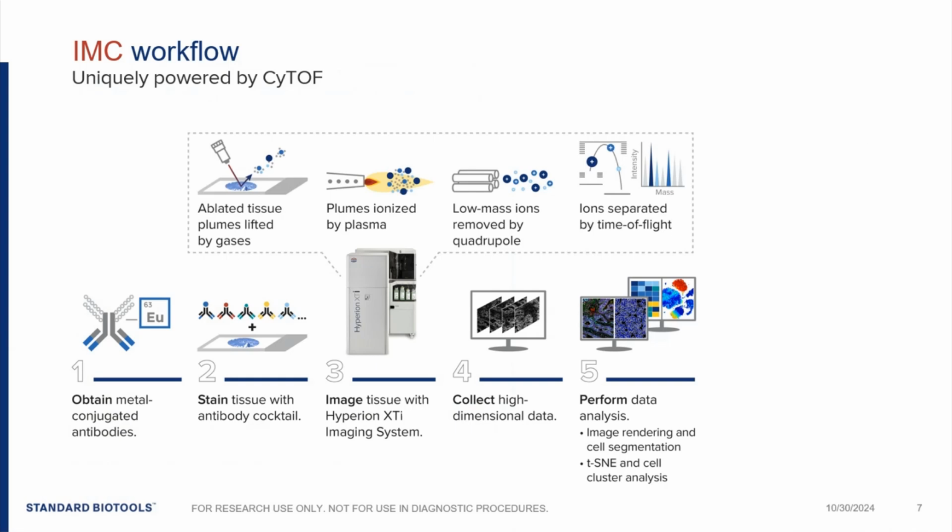So this methodology has several key advantages in comparison to fluorescence-based methods. First, we're not using fluorescence at all. So the generated images do not display any autofluorescence signal. This is actually quite advantageous if you're working with highly autofluorescent tissue specimens.